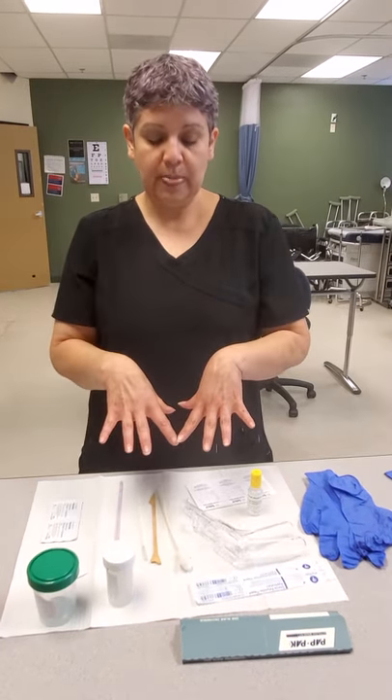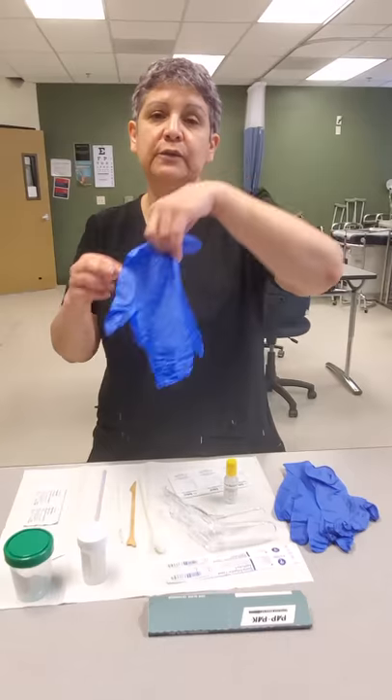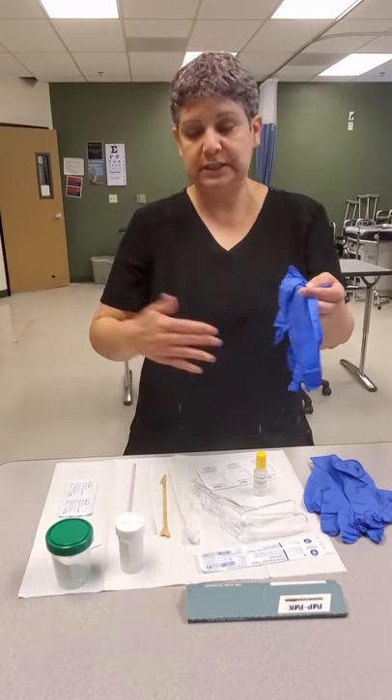Now when we do a pap smear, the reason pap smears are being done is we are looking for cancer cells in the cervix. So when we use all this equipment, it's to diagnose specifically for that. Two gloves are for the MA to use as she is assisting the provider.